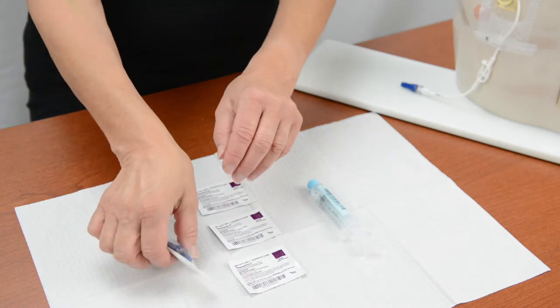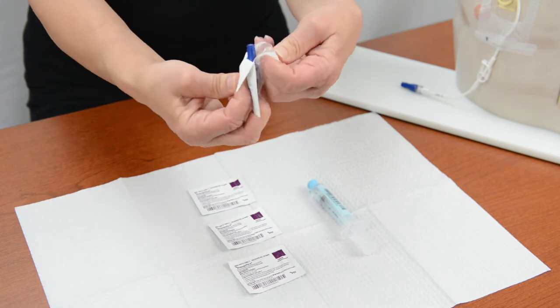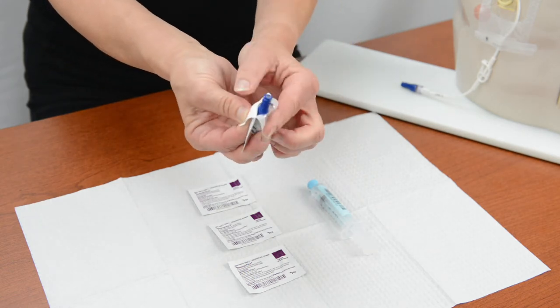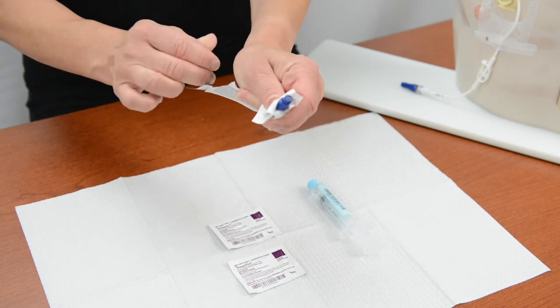Next, peel open the needleless connector package on the hub end of the connector. Leave the package in place to protect the other end of the connector. Do not touch the open end of the connector.